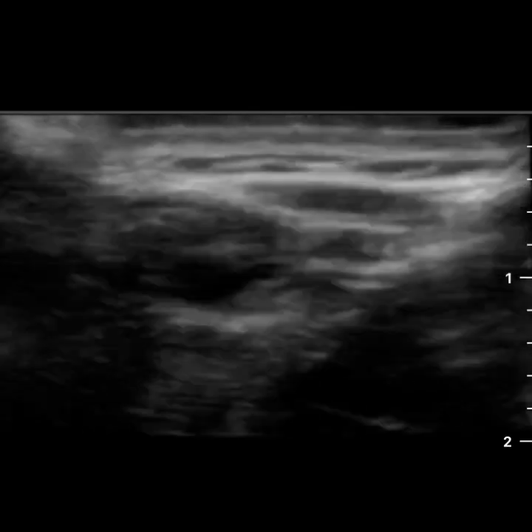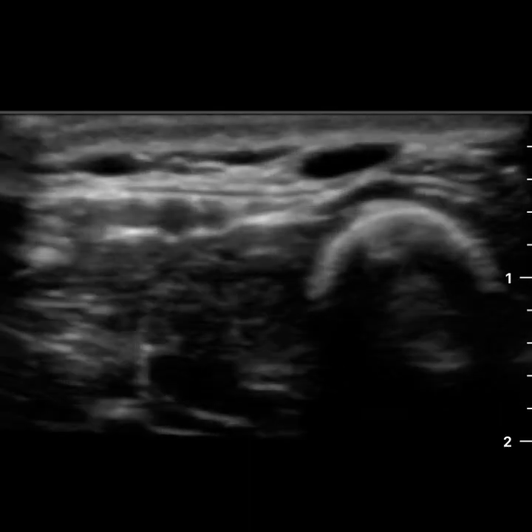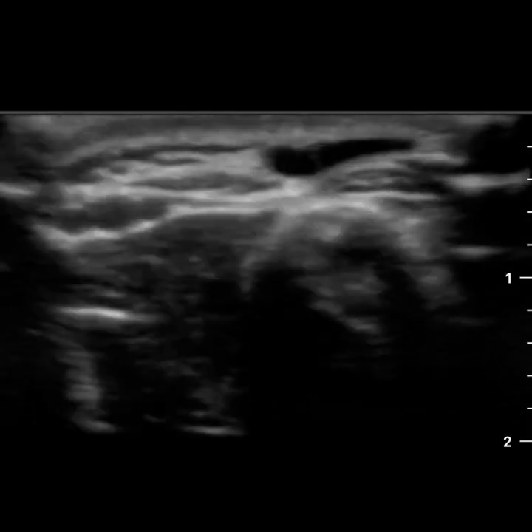This is a short demo on the superficial imaging of the Butterfly IQ. This first preset is the nerve preset and I'm following the superficial radial nerve.